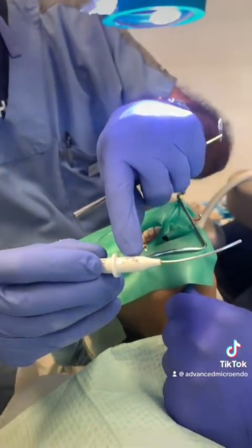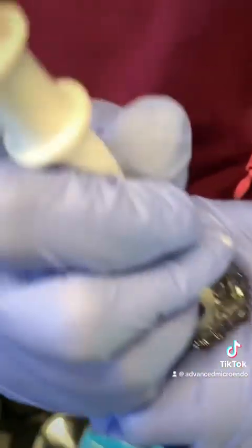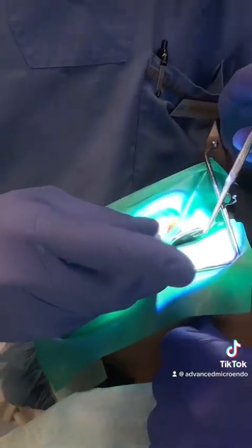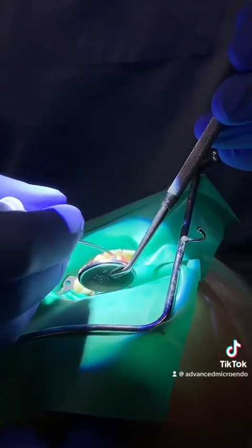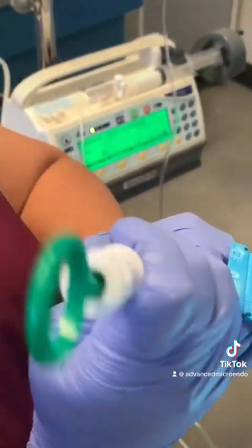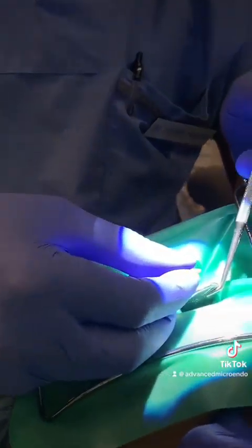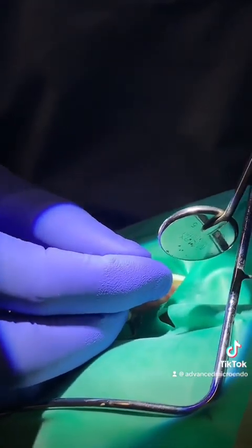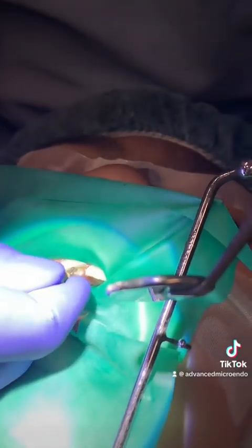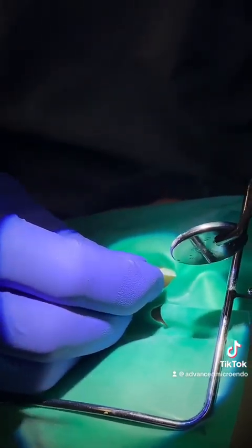MTA carrier by Vista, and I like the green. So I usually put 2 or 3 loads in the canal before I use my file to push the MTA to the apical terminus. All right, the 70 file now. I push the 3 loads that I put in to about 0.5 millimeter short of my working length. I don't push it all the way to working length, because then I'm just extruding the MTA right out of the canal. It doesn't matter if that happens, but I want to have some control.